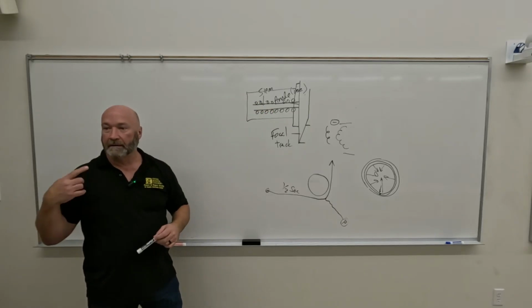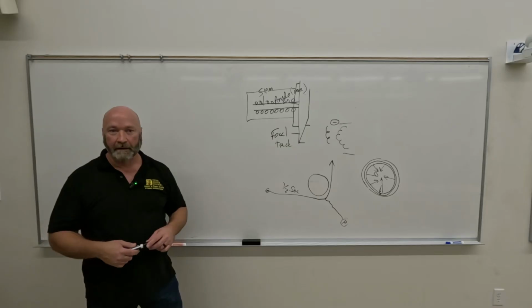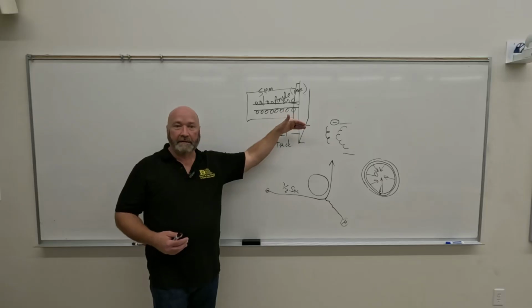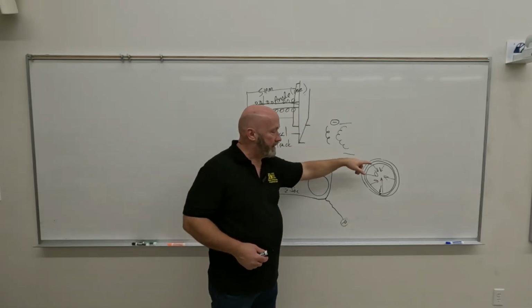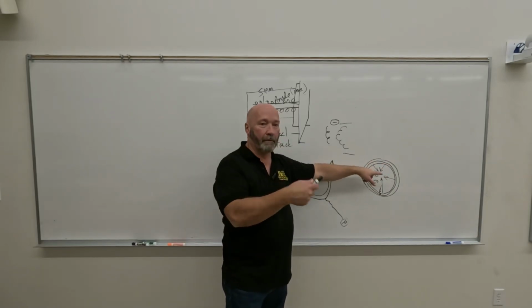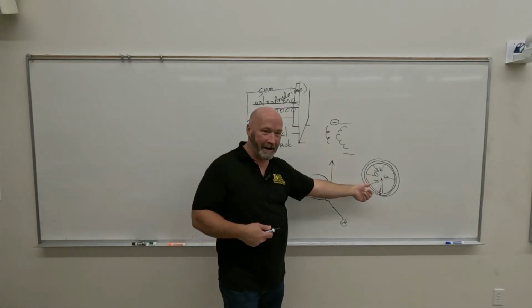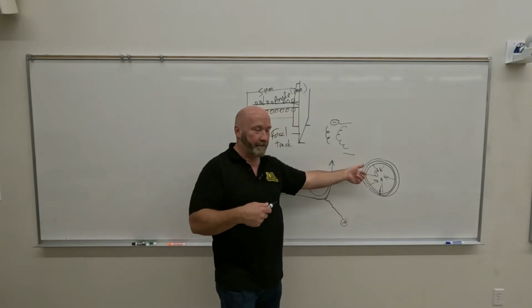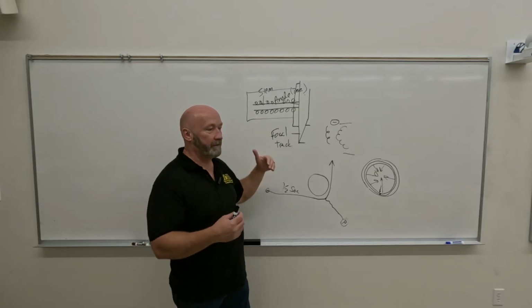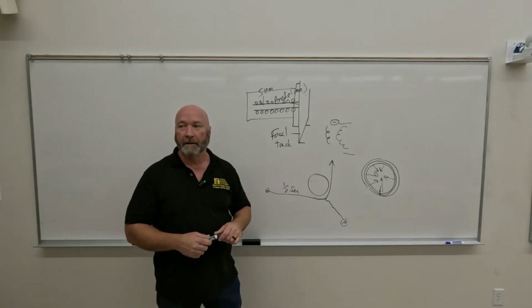Eventually, when you get a tube that's old enough, you'll hear it. You get this grinding sound every time you rotor up. As you rotor up, if the grease on the bearings is exhausted because of the heat, the rotation of that anode is going to slow down some, which is going to cause you to build up more heat, which is going to affect your bearings, which is going to cause it to slow down some and build up heat. It's a negative cycle, and eventually the bearings will seize up, weld together, and at that point you've got a stationary anode.